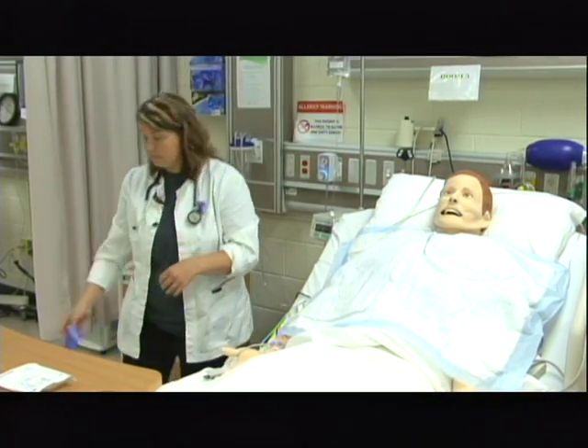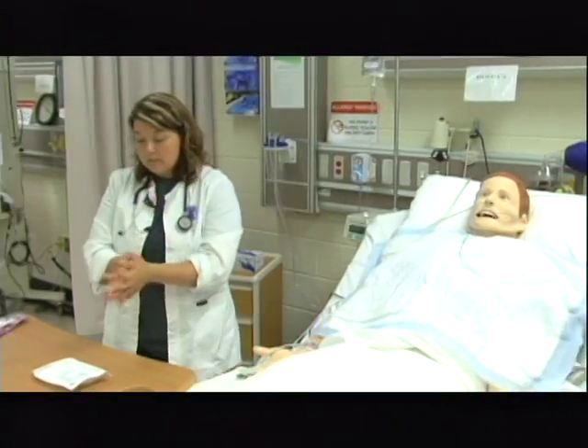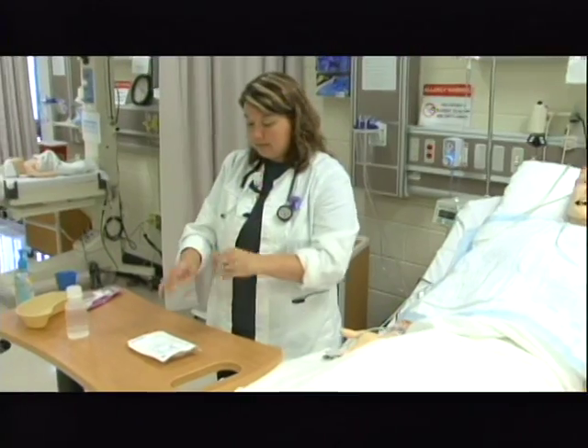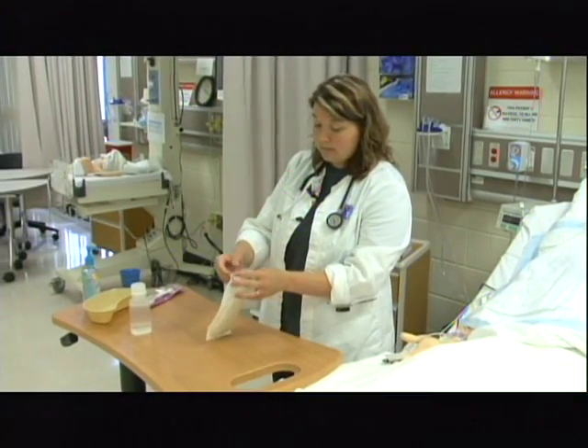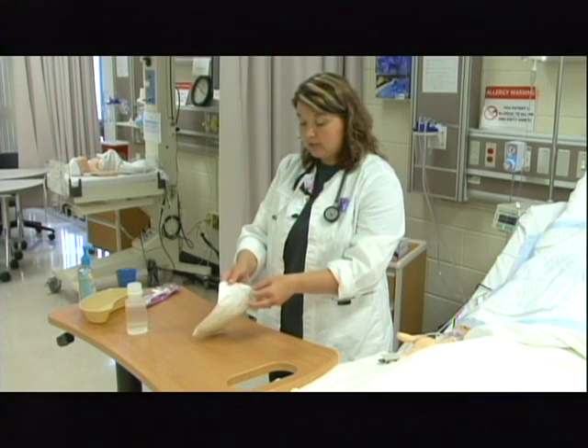I'm going to take off the clean glove. I'm going to come back over and foam again. I'm going to come back over to my catheter and glove kit and open this up, following procedure for sterile technique and establishing a sterile field.